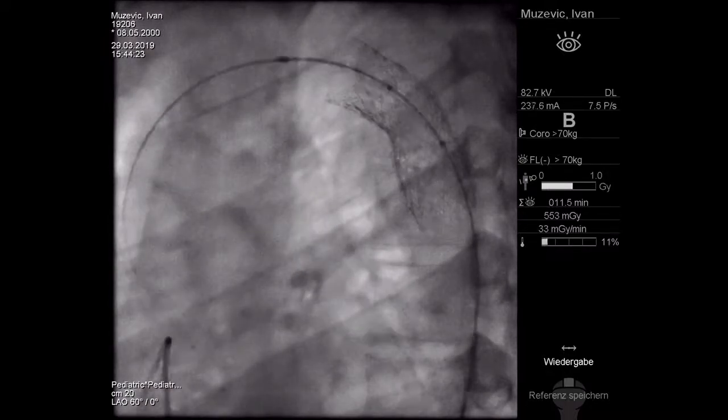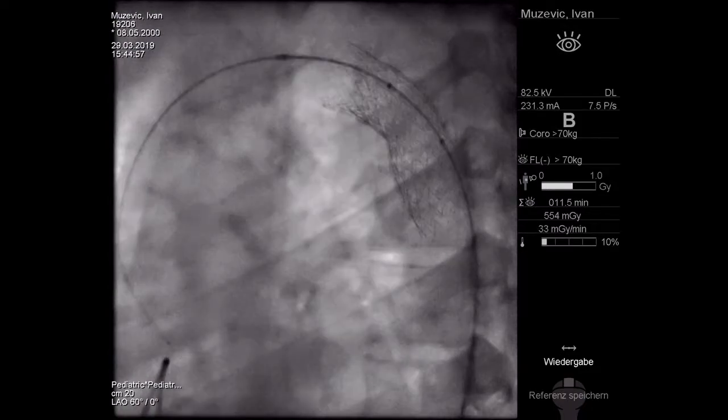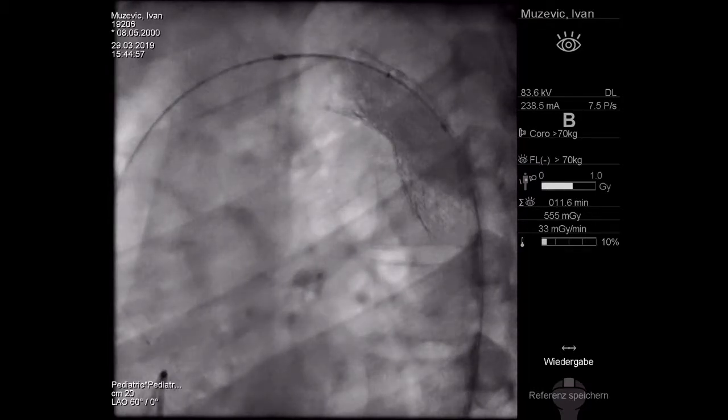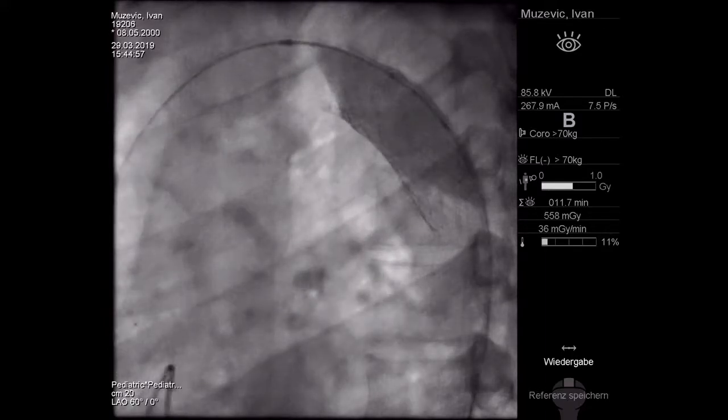So here you want to have it, right? Yeah. Okay. Just want to de-air the balloon once again, and then we go. Okay, ready? I don't know whether this is enough. You think it's enough? Okay, we tried. Okay. Here we go. 10. 10. 12. 12. Okay, out.